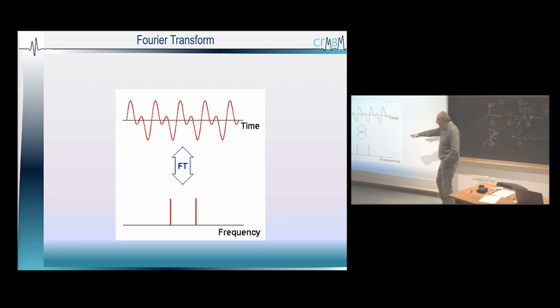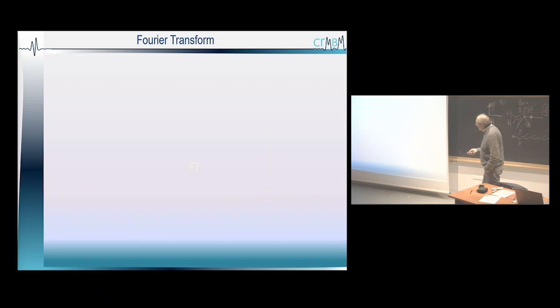You've got two frequencies in here, so it means that you've got two families of frequencies, so two families of proton. So if you do a proton spectroscopy of any kind of organ, if you do the Fourier transformation of this, you'll get two signals, one related to water and one related to fat, mainly, okay?